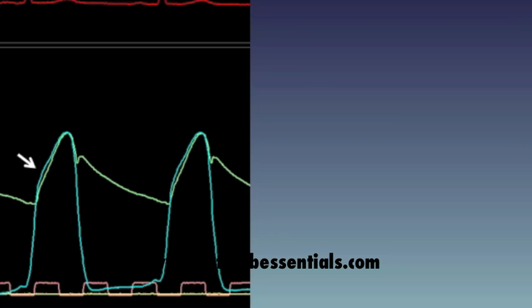Let's take a moment and look at the hemodynamics. Here we see a normal left ventricular and aortic pressure tracing, in which the two measurements are made on a single catheter with a high fidelity micromanometer set of pressure transducers, one in the LV and one in the aorta. If we start our examination at the beginning of systole, that is at the end of diastole, if you drop a line from the QRS R wave to the LV pressure, you'll see that that is the LV EDP.